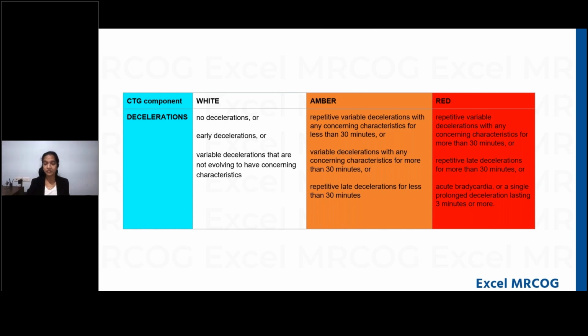For that matter, a better example would be if the patient is bleeding and there are variable decelerations, and the patient is far from delivery, in early labor. Again, you would consider delivery because you would be concerned about the baby, right? So that is what you need to remember. The most important factor in the interpretation is DR, C. BRAVADO, DR, determine risk.